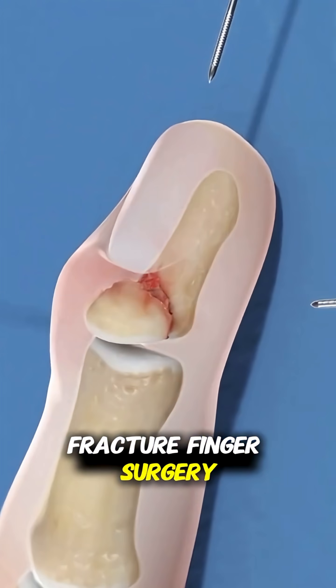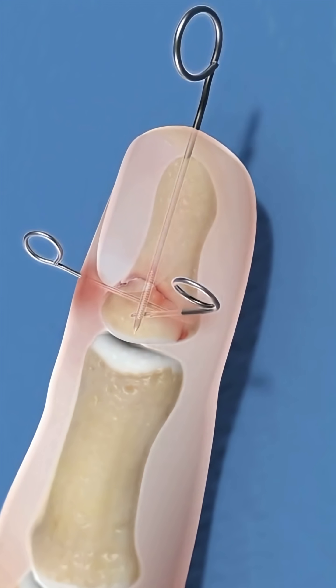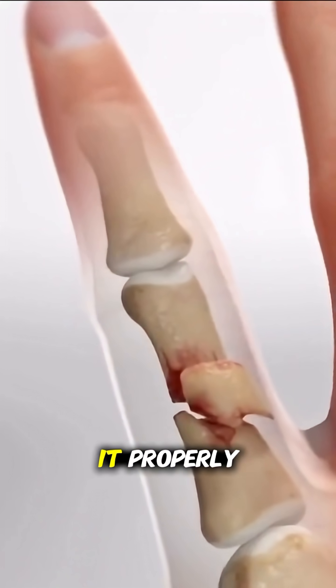Ever wondered how fracture finger surgery is performed? Let me walk you through it in about 70 seconds. When a finger bone breaks and is misaligned or unstable, surgery might be needed to fix it properly.